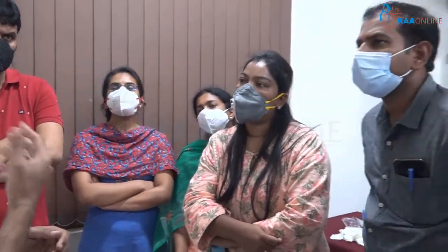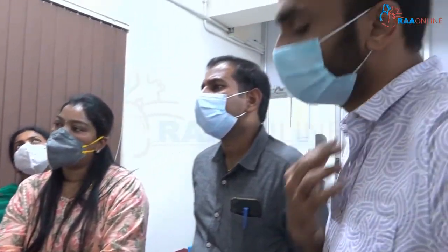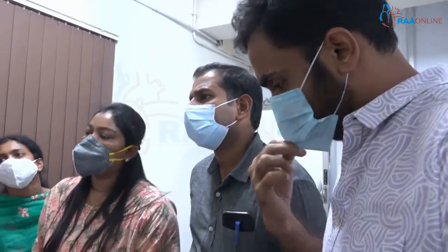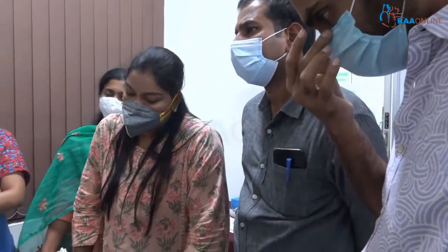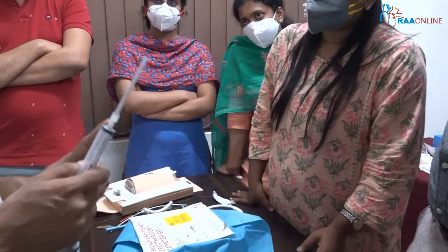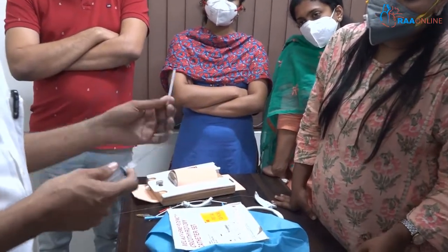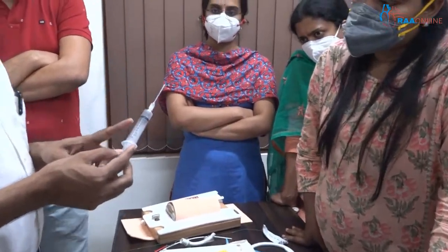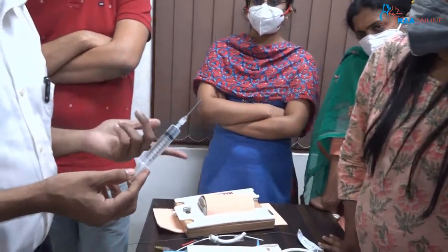If time permits, position the patient. When you extend the neck, the strap muscles move laterally so the anatomical structure we want to puncture becomes superficial. If time permits, apply sterile precautions. Take the syringe and needle with a little saline or local anesthetic.